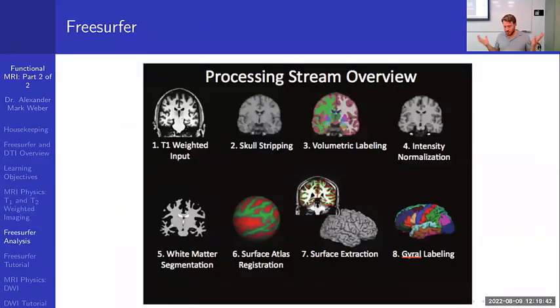Okay, so you might be wondering why I'm talking about T1 weighted imaging for this talk. The reason is we typically will want to have a T1 weighted image. We saw it in our fMRI, where we wanted some good anatomical information. In adults, T1 pretty much gives us our best tissue contrast, and so that's our workhorse for that.